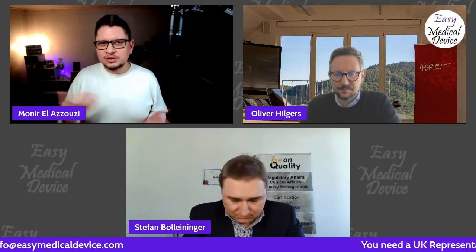The issue is mainly that when we say Class 1, we say self-certified, and then it's like the Far West, like nobody's checking, nobody's looking. But even if it's Class 1 self-certified, you have the obligation to have a technical file, a quality management system, and to write this declaration of conformity where you say, I declare that I am following the legislation, etc. It's like a letter saying, I am committing to do this and that. If you are not doing that, then you have nothing. So this is mainly the issue when we talk about Class 1.